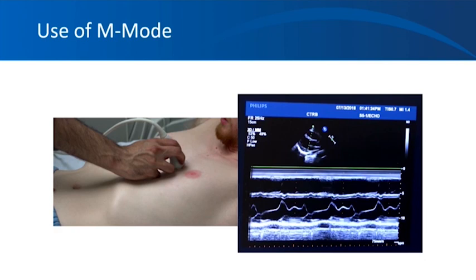That's the purpose we are looking at the mitral valve. If your ejection has reduced, you have more blood in the ventricle, and you have ultimately less blood flow through the mitral valve. But be cautious, because it may also be seen with the dilated LV, aortic regurgitation, and mitral stenosis. In these conditions, EPSS may be more than 7 millimeters. So interpret in the right clinical context.